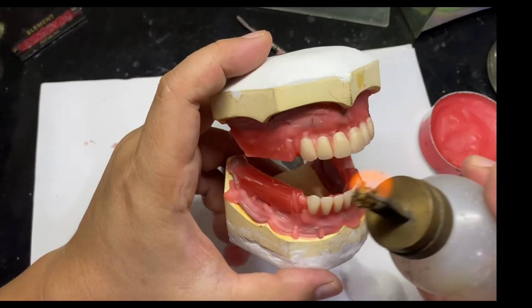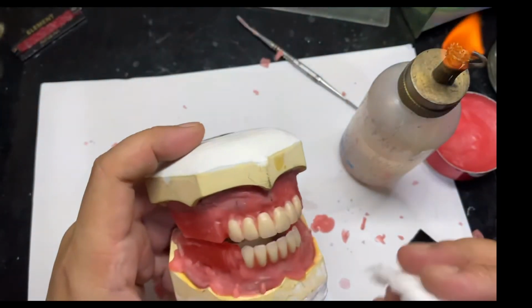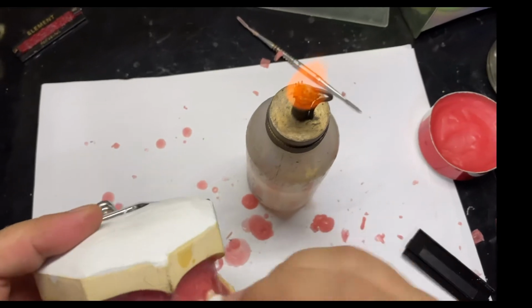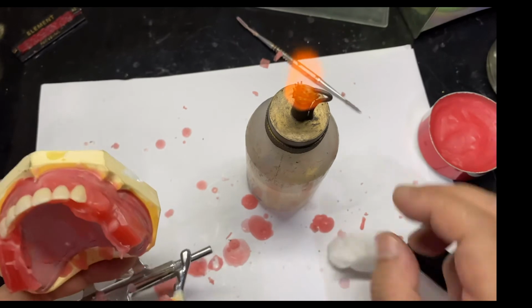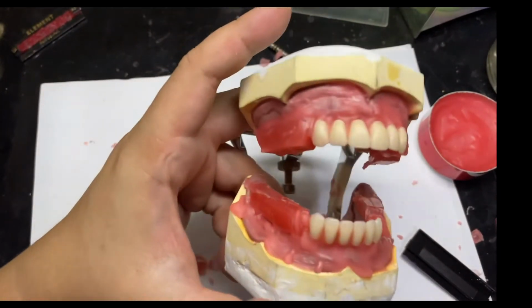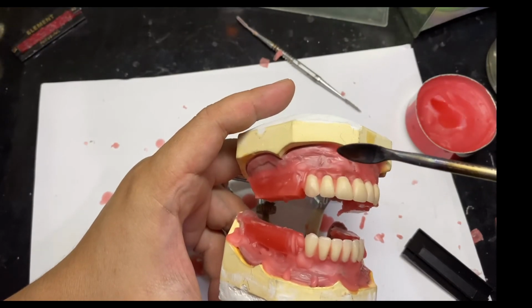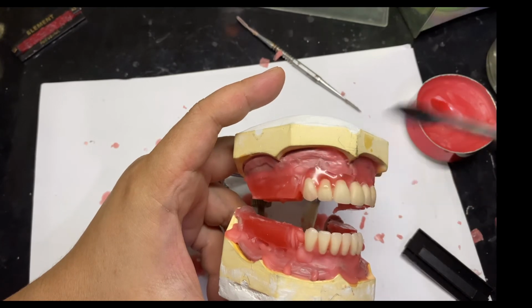And then try to use your torch and then use a cotton to wipe. Now I'm going to add wax on the cervical area, just to make sure that this one will not move whenever I do festooning or setting of the posterior.